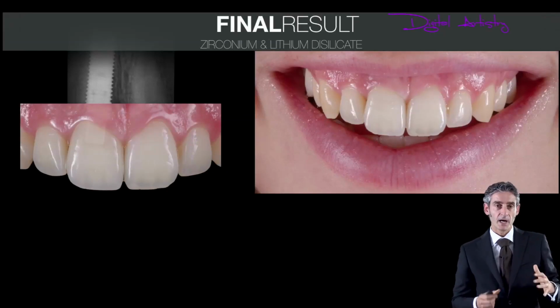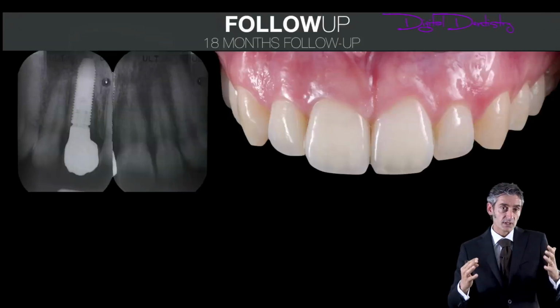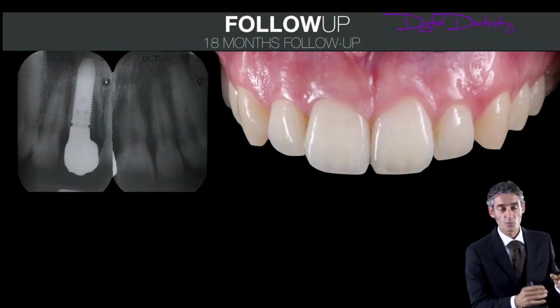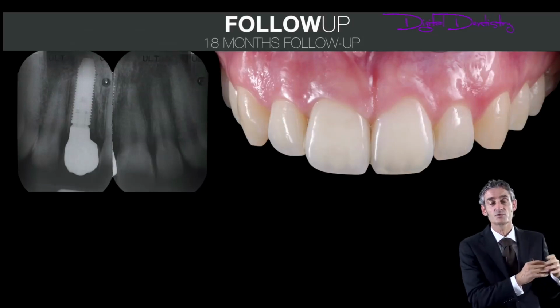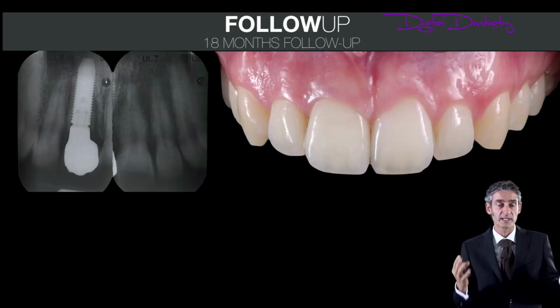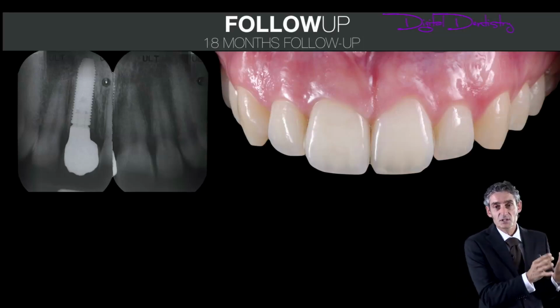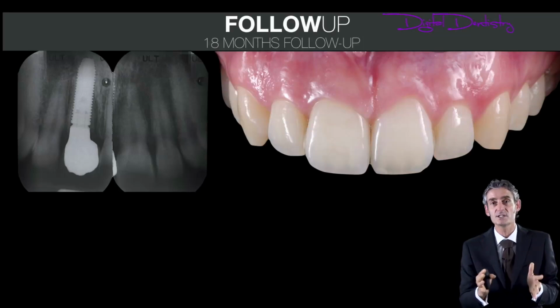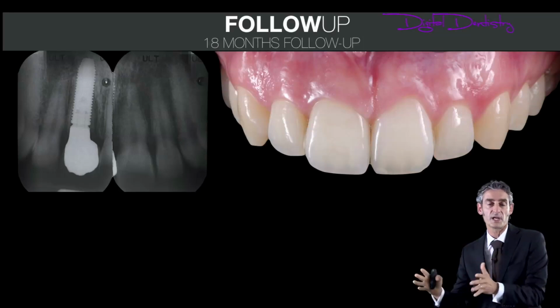And I hope that you understood a little bit about this digital approach, what the digital patient is that we normally use for full mouth rehabilitation or big cases, or the digital path for simple cases, or not simple, but cases where we don't need to have the digital patient.